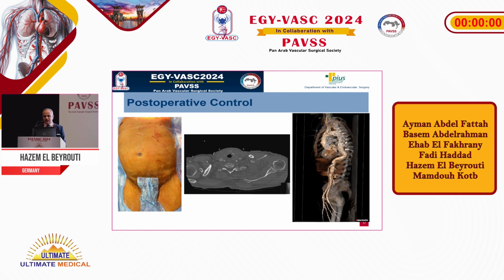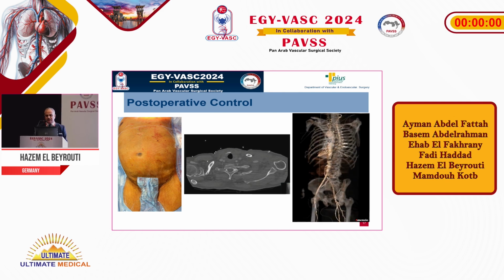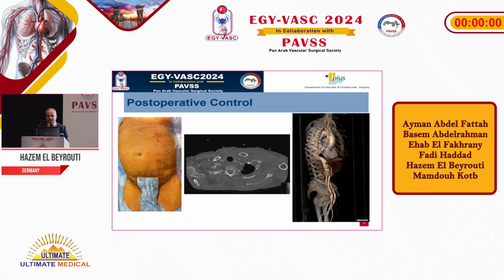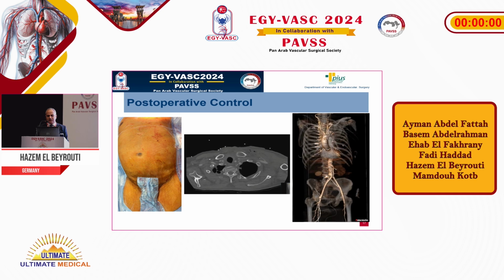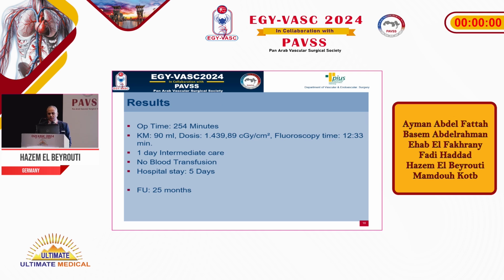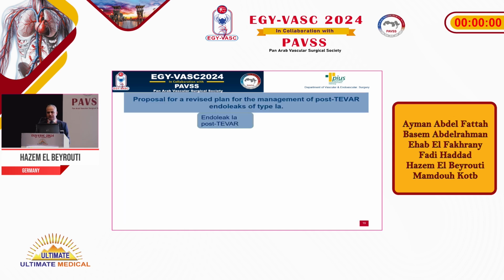Here you can see the postoperative control CT, confirming complete exclusion of the endoleak and patent subclavian-to-carotid and LIMA bypasses. The operation time was 250 minutes, contrast was 90 milliliters, and the patient was discharged after 5 days, and we have a follow-up of now 2 years.